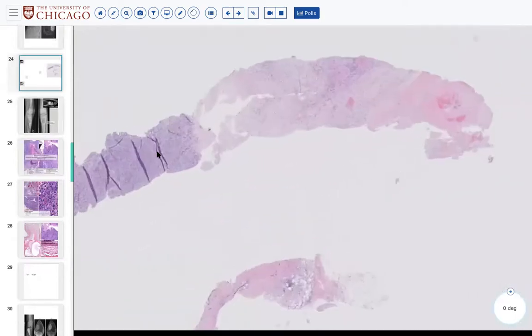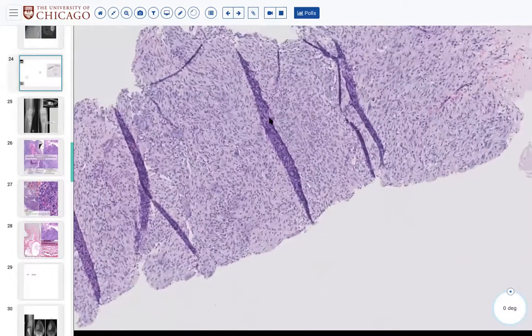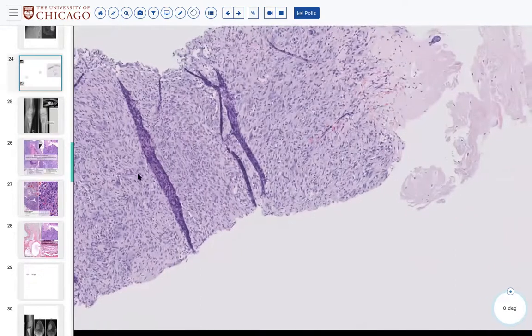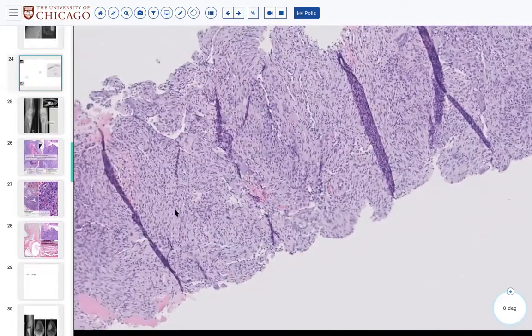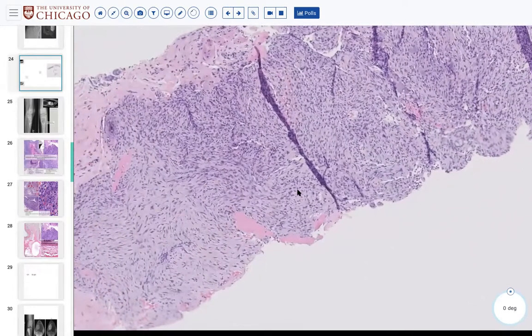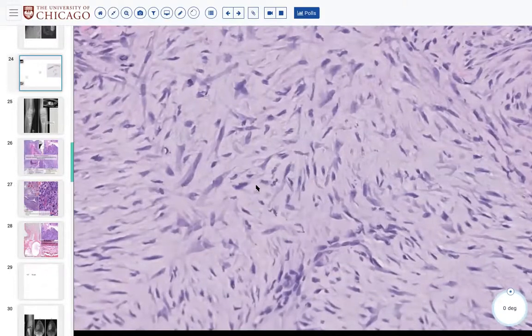So yes, non-ossifying fibroma and what this turns out to be, which is a solid aneurysmal, or relatively solid aneurysmal bone cyst, both have osteoclast-like giant cells, both have fibrocellular stroma. Arguably, the stroma in the background here, would you describe it as a little more tissue culture-y, or would you describe it as more storiform?